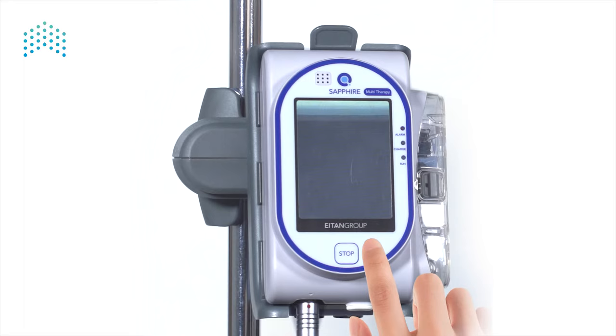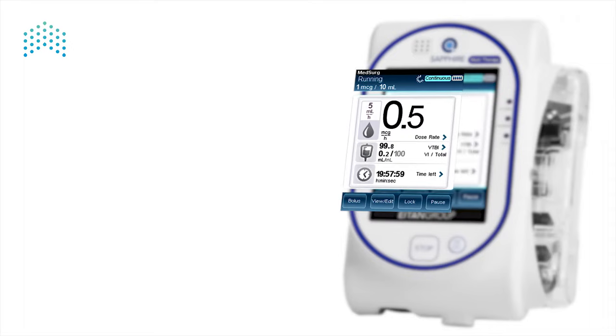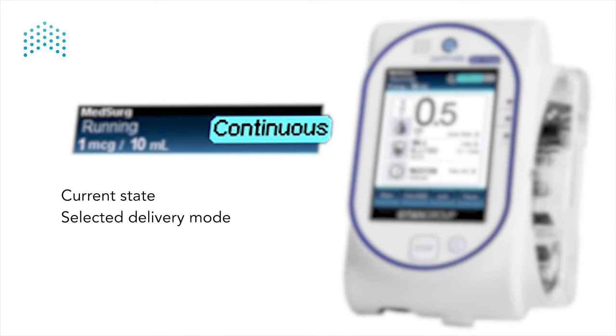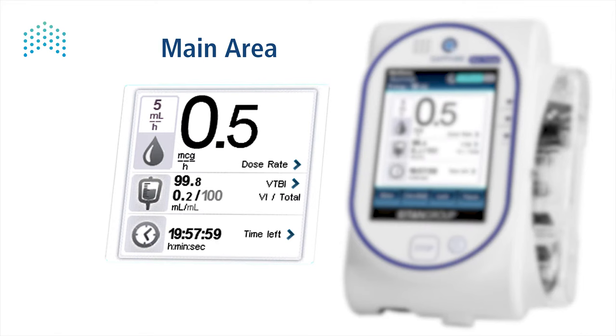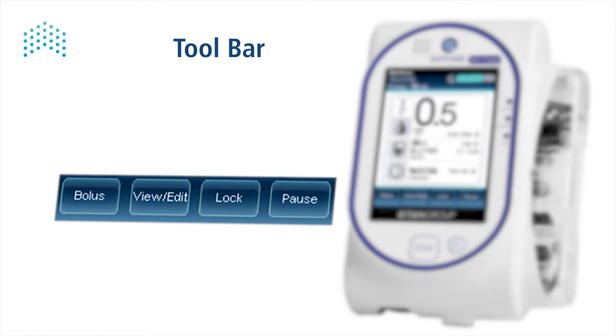The pump can then be programmed and connected to the patient. To turn on the pump, press the on/off key. The screen is divided into three sections: the indication bar, showing the current state, the selected delivery mode, and battery level. If there is a drug library, the clinical care area and drug name are also shown.